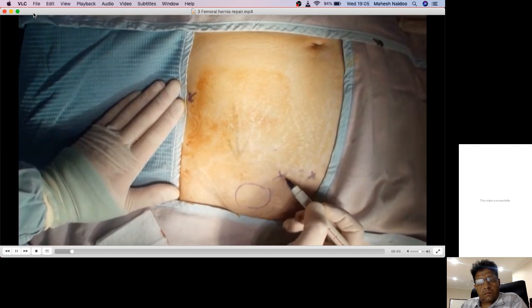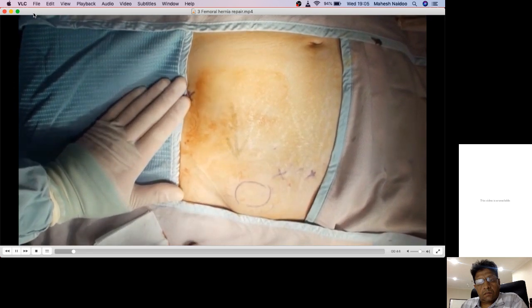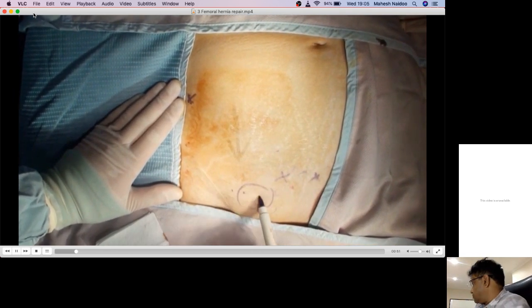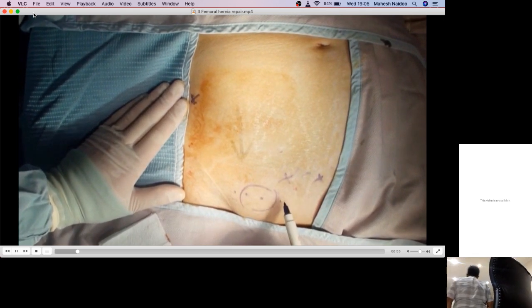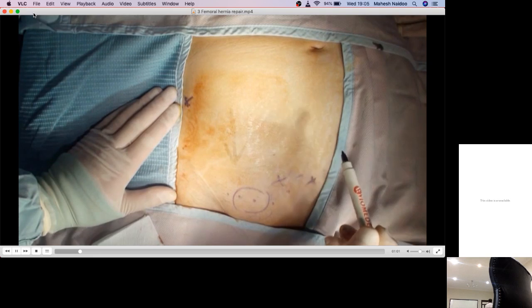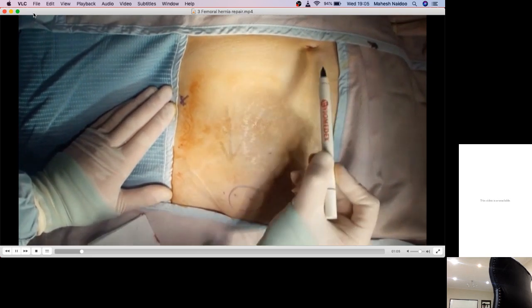An inguinal hernia will emerge medial and superior to the pubic tubercle. So there's a number of approaches to sort this hernia out. We could do a low Lockwood approach. That would be for an elective case where we're not worrying about incarcerated bowel. We are worried about incarcerated bowel in this lady clinically. She's been vomiting and her bowels haven't opened. So we want to do a higher approach. One approach is a midline laparotomy, which is a bit of an overkill.